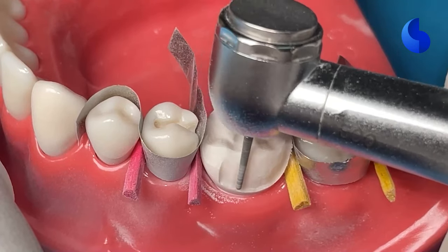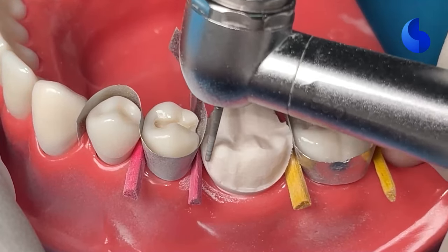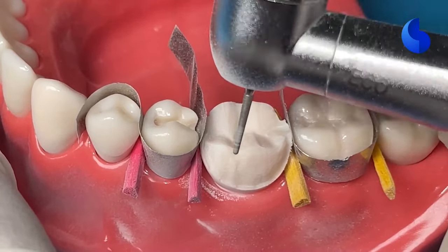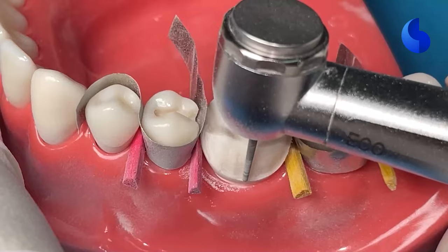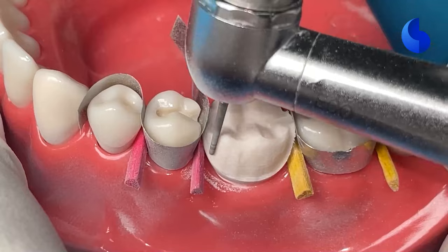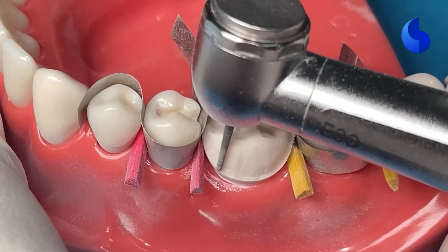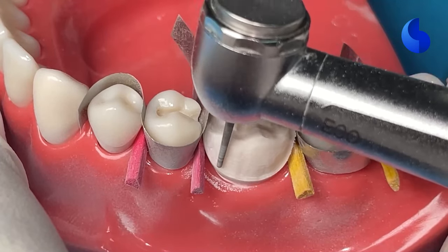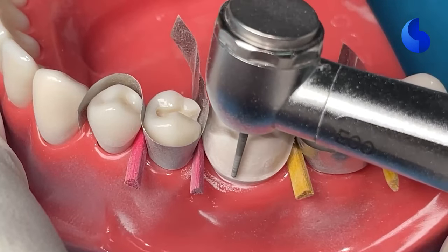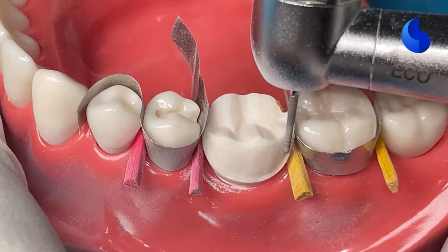You continue to remove these islands of tooth structure and you go into the interproximal surface, until you get an even reduction of all parts of this buccal axial surface. Now we're getting closer to completing our axial reduction. As you can see, the wedges that we have used all throughout the occlusal and the axial reduction are going to help us when we do the proximal reduction, because it's going to give you some separation of the teeth.